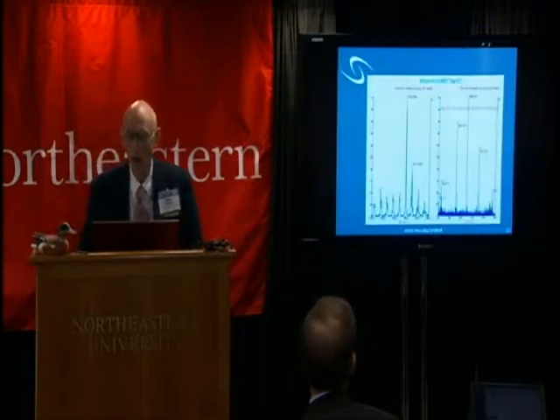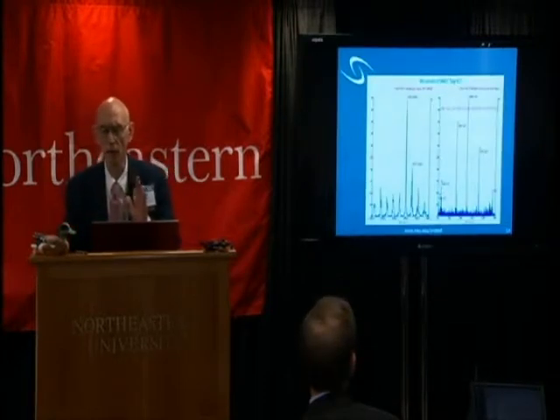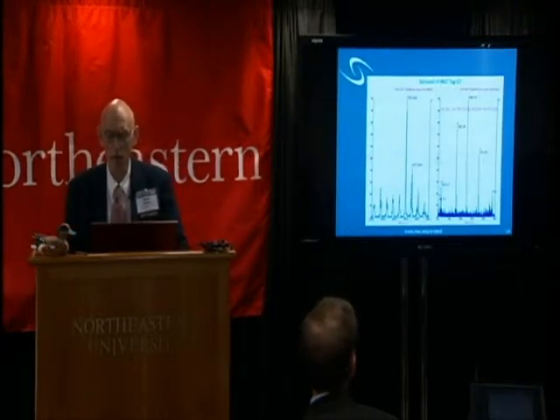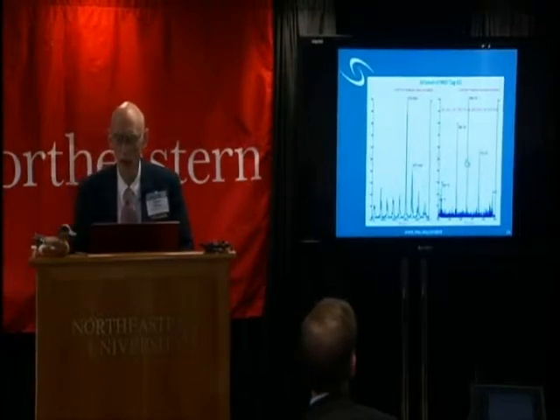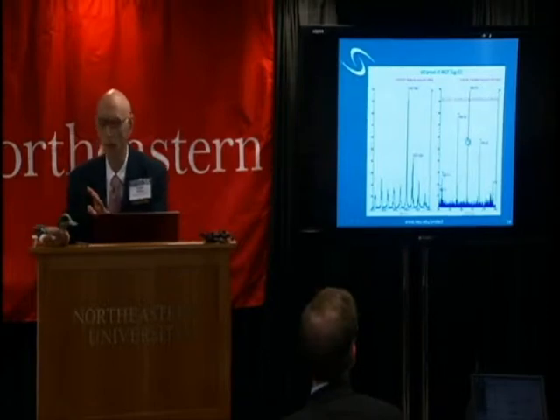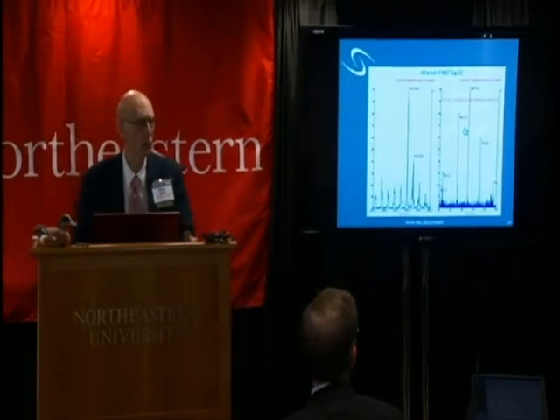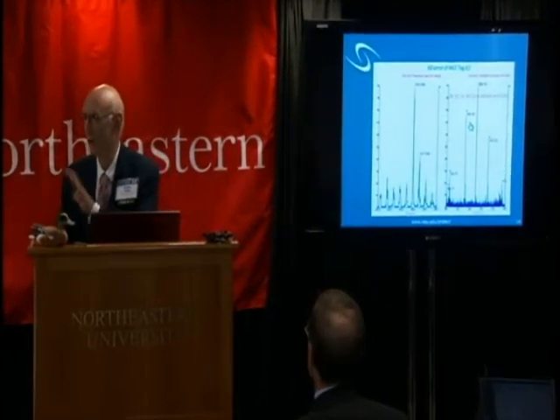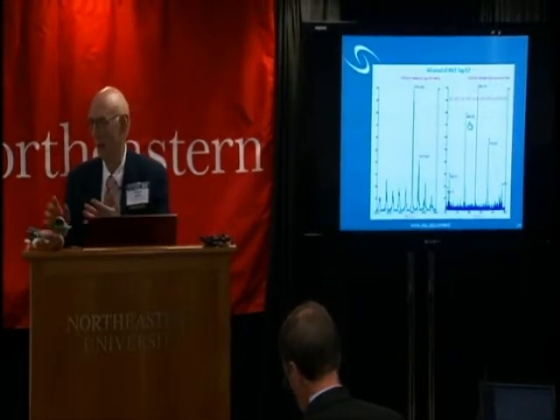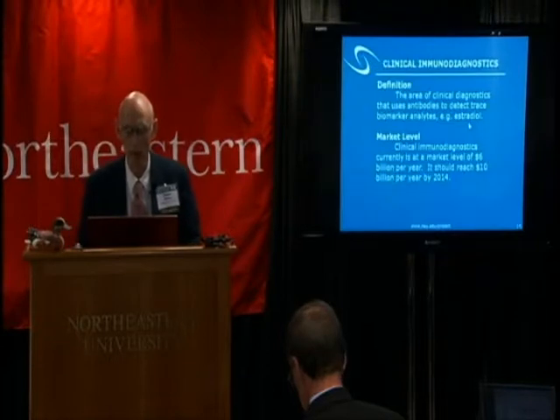estradiol. We have developed an intensified neutral loss tag for estradiol, and here we see on the right-hand side we have 2 ions that are characteristic of the estradiol, and our sensitivity is about 1,000-fold more than what the Mayo Clinic has with their Dansyl tag, and so this is an assay that we're moving towards application.